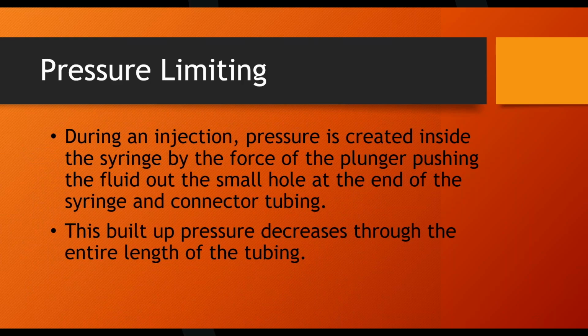So right here I have my injector head, and there's my syringe on one side, and this actually has 2 syringes. Spoiler alert, the green side is contrast fluid. The blue side is saline or water. This is the contrast fluid, and this is what they refer to as the flush solution. There are a few purposes of this fluid, but primarily it's the fluid that helps push the contrast out of the body or out of the heart chambers once the injection is complete.